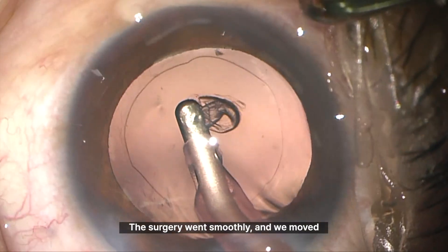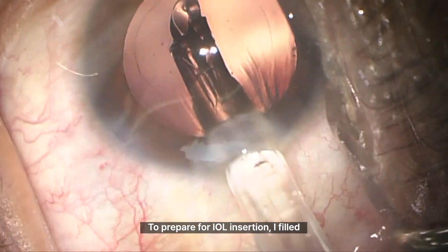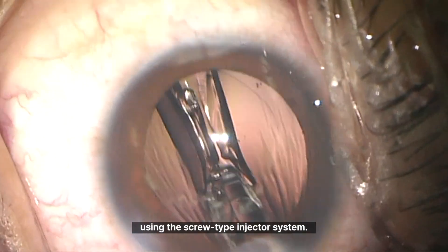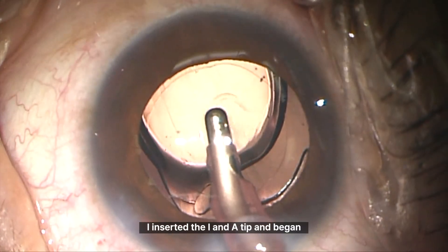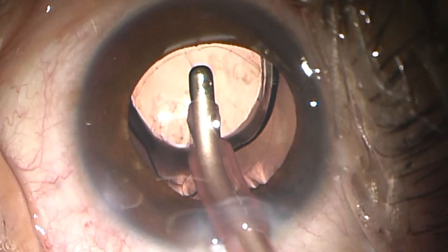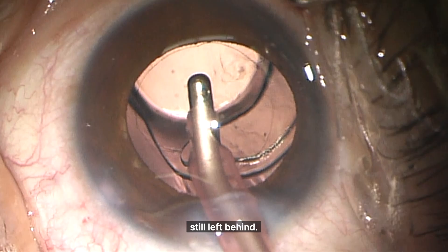The surgery went smoothly and we moved toward the final steps. To prepare for IOL insertion, I filled the capsular bag with viscoelastic. Then, as I always do, I inserted a preloaded one-piece IOL using the screw-type injector system. I inserted the I&A tip and began removing the viscoelastic, but then something felt off. The IOL looked tilted, slightly shifted to one side. I thought maybe it's just a bit of viscoelastic still left behind — nothing unusual.